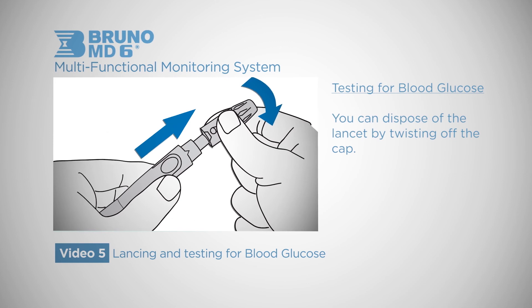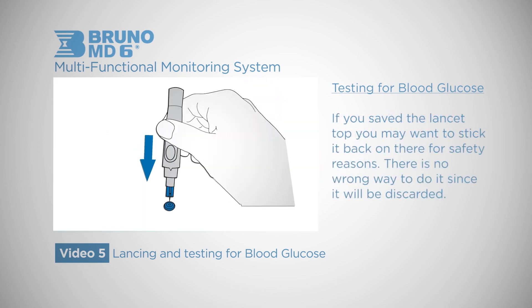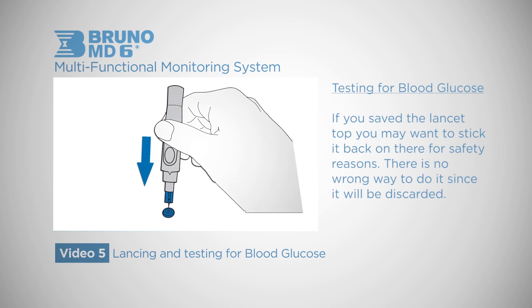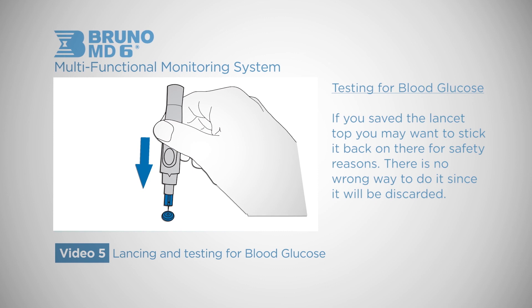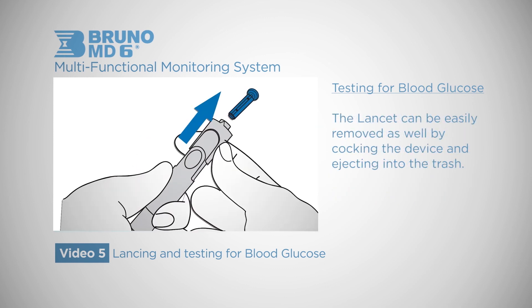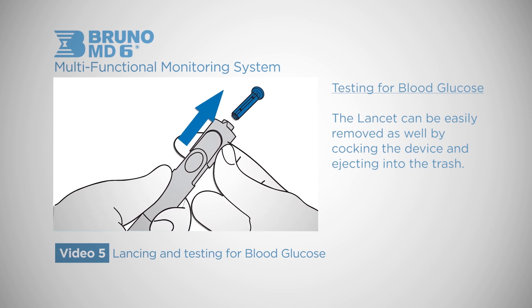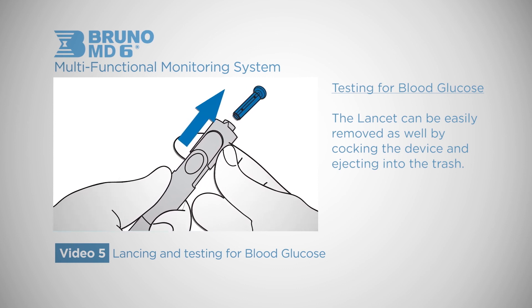You can dispose of the lancet by twisting off the cap. If you saved the lancet top, you may want to stick it back on for safety reasons — there is no wrong way to do it since it will be discarded. The lancet can also be easily removed by cocking the device and ejecting it into the trash. In the event you jammed the lancet down too far, you can pull it out as well.